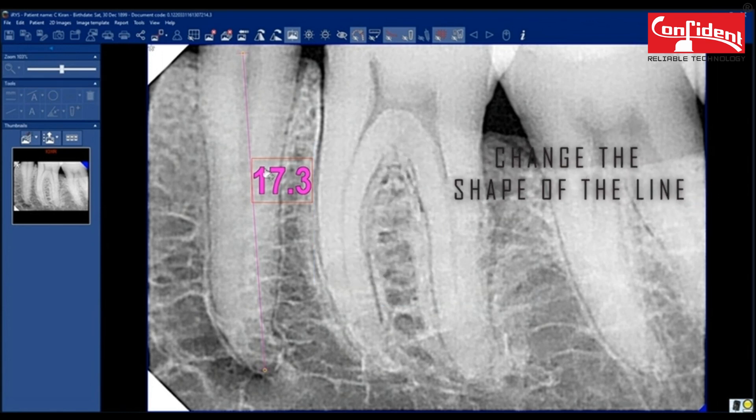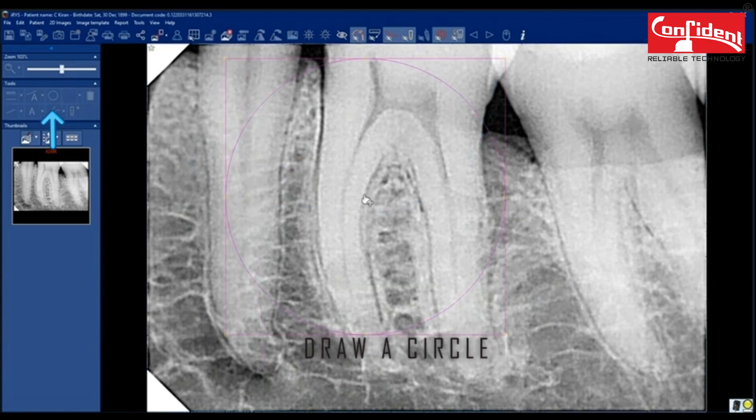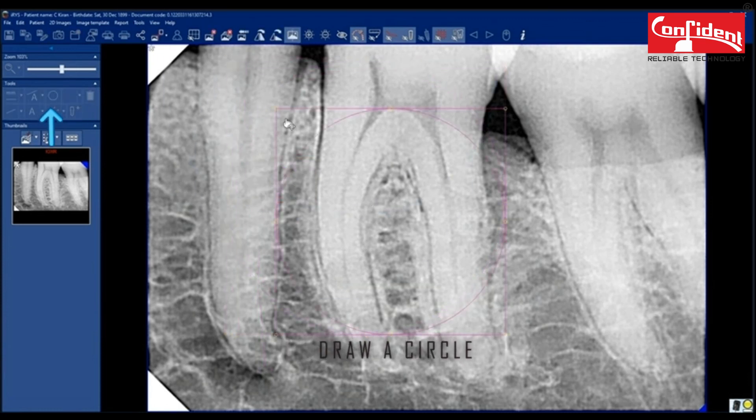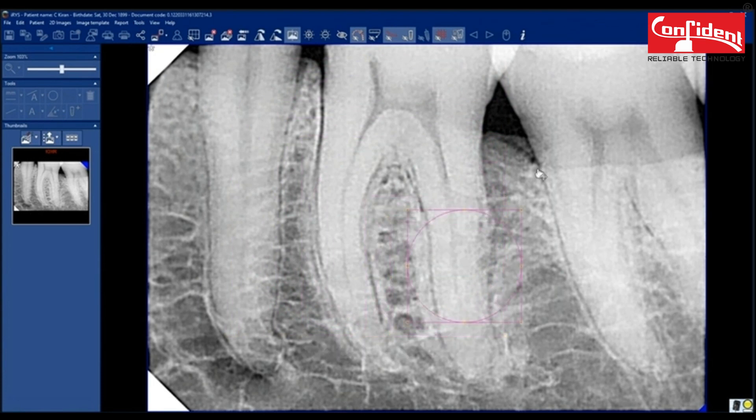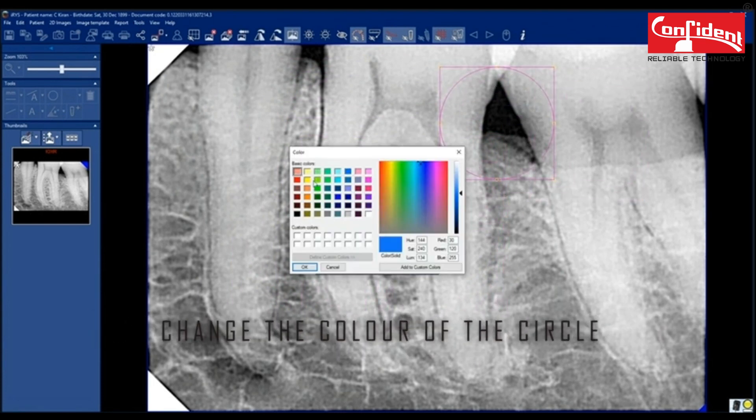If you want to delete a font or a line, simply select and delete. Draw a circle to point a portion of the image. Change the color if you wish.